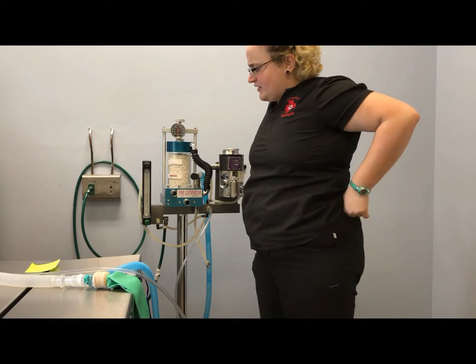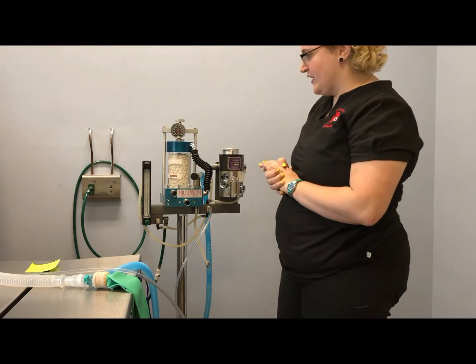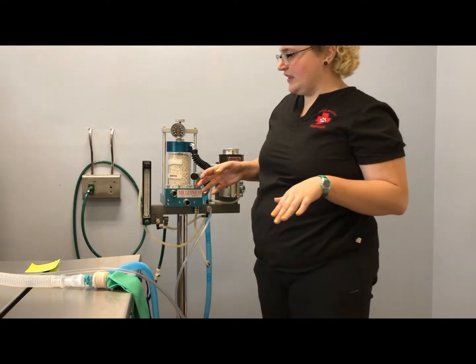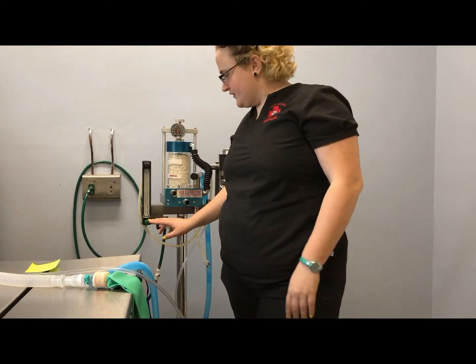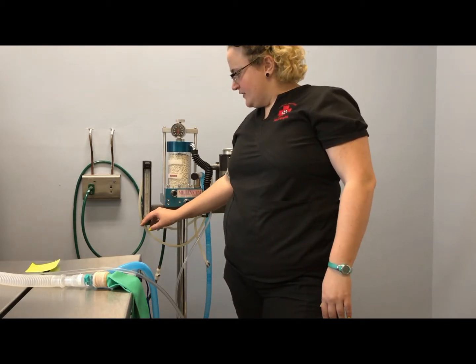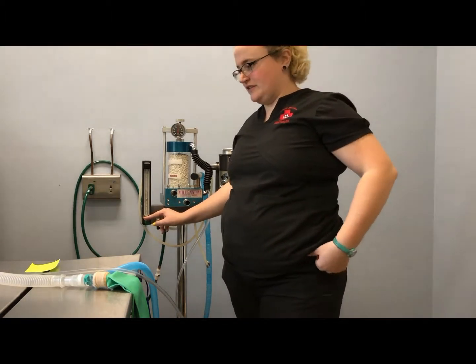Oxygen through the machine with a non-rebreather comes through the oxygen tank and enters our flow meter first. This is where we set our rate for how much oxygen — how many liters — are being given.